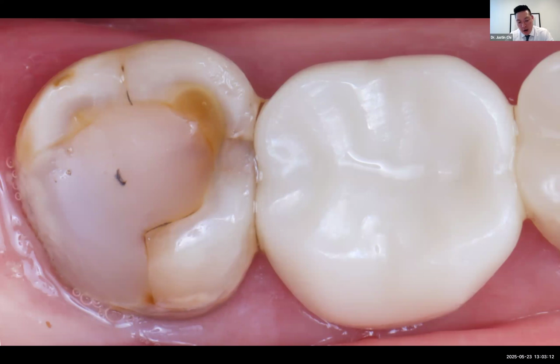After you have an air-abraded, clean Bruxer surface, then you're going to need to apply a phosphate primer, a zirconia primer, a product like Z Prime, Monobond Plus. I think Clearfil Ceramic Primer Plus is also a good one. But just make sure it has something for zirconia priming, which usually entails an MDP or phosphate-type primer. Once that is applied, that is essentially how you pre-treat zirconia for bonding.